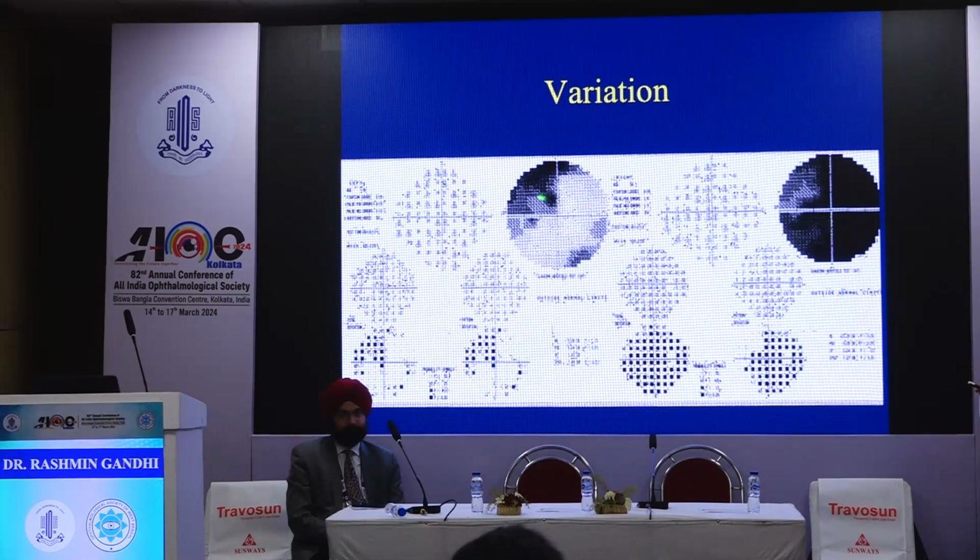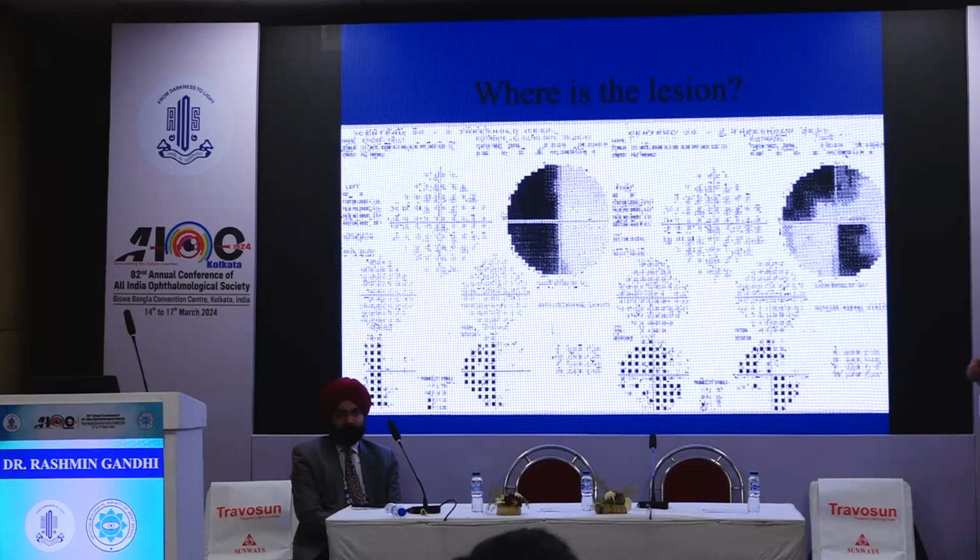Now couple it with, so this is a blind spot here. So couple it with a supratemporal defect in the other eye. This again is a sign of a chiasmal lesion. This is called junctional scotoma, an optic nerve lesion on one side and a supratemporal lesion on the other side. So this is again a feature of optic chiasmal lesion.